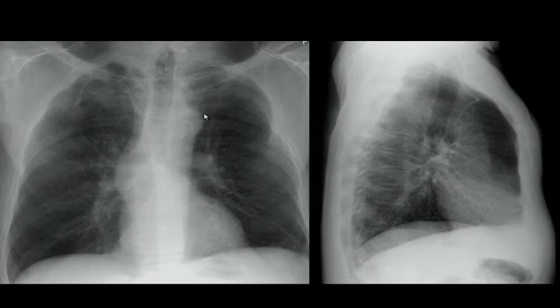It's classic. You will see a small teat-like projection or a nipple sitting on the aorta. In the past, when I did my residency, we did it when the x-rays were on film. So we would save these extras or duplicate them in teaching files. Somebody would say, oh, it's an aneurysm or pseudoaneurysm. No, no, no, this is the left superior intercostal vein.